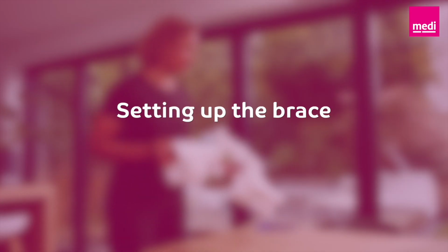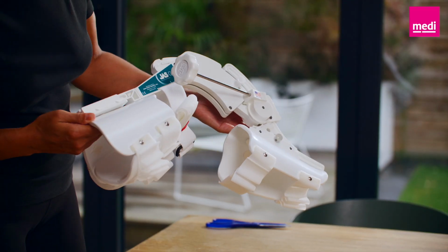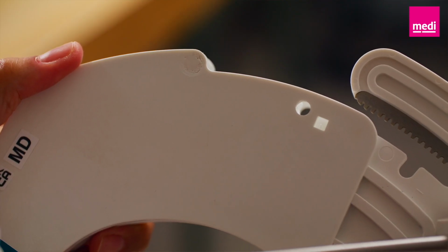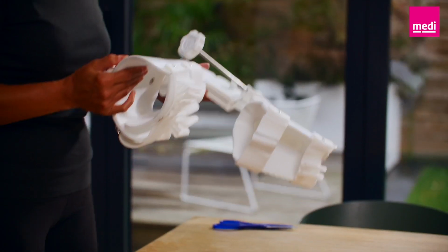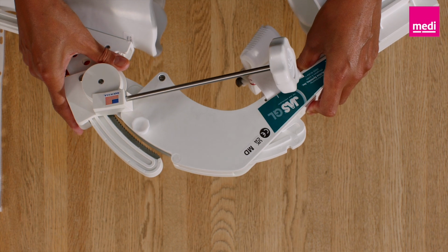Setting up the brace. There are 4 pin settings that control how much the brace bends your knee. Most people begin their therapy on pin setting 1 or 2. Before you start, adjust the pull pin to the setting that matches the furthest you can comfortably bend your knee.